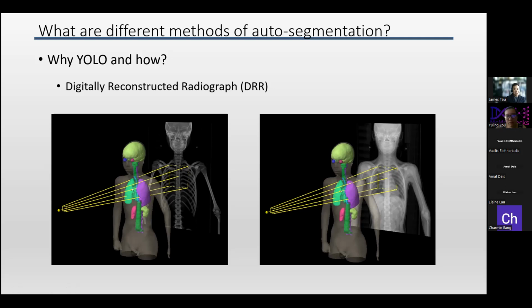You could clip the Hounsfield unit. On a CT scan, Hounsfield unit is the pixel intensity, and it has a physical correlate. It actually means the density of the material. That's important for radiation therapy because the more dense the material, bone for example, the more radiation you absorb. And because it absorbs so much radiation, it blocks the photons from hitting the film. That's why it looks like that on the film if you're looking at the bone window.